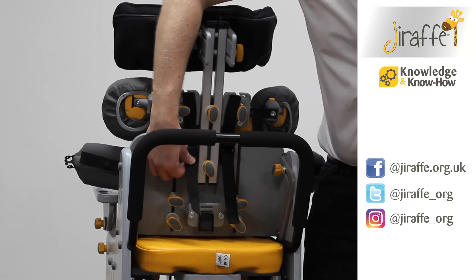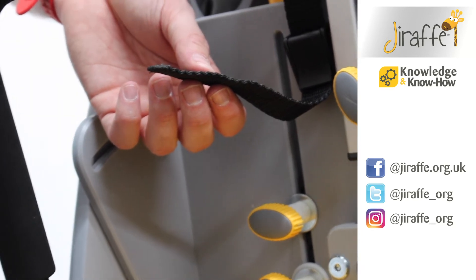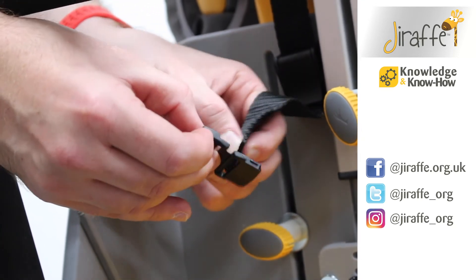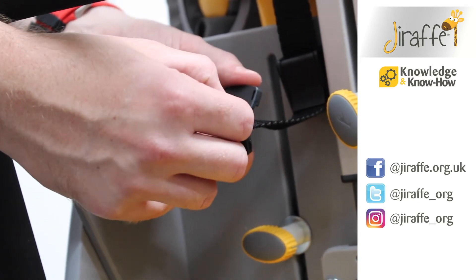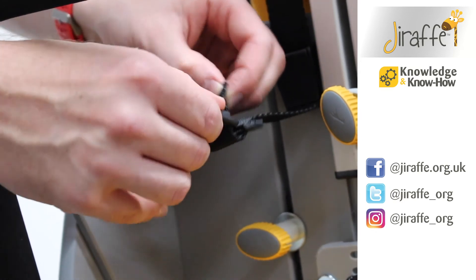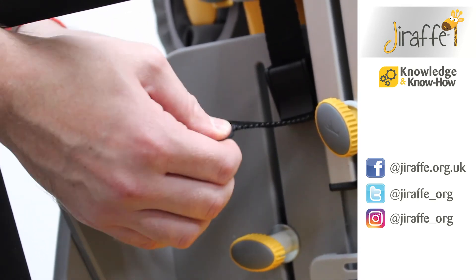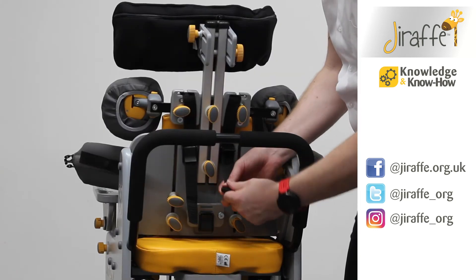Now once all of your straps are in place, ensure that you fit each strap with the safety clip by feeding it through the bottom, back up through the top.